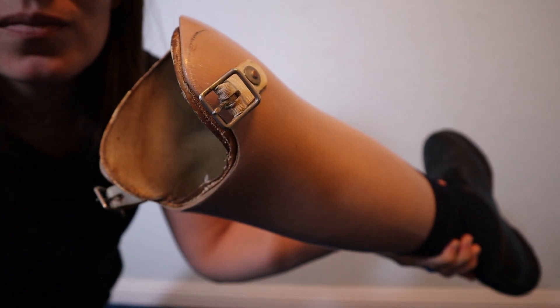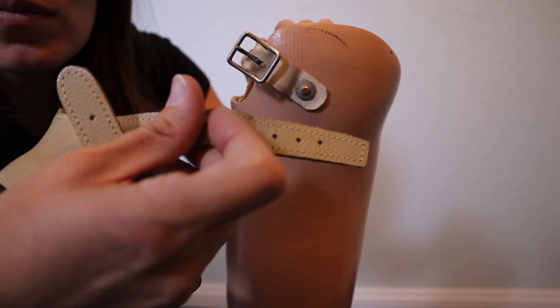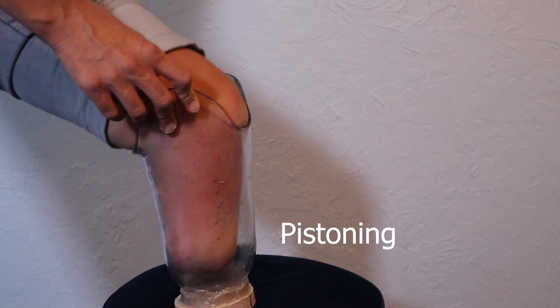How do prosthetic limbs stay on? But what do you do if you run out of duct tape? Back in the olden days, straps were used, but that's uncomfortable because not only do the straps rub your leg, but your residual limb tends to piston as you walk.